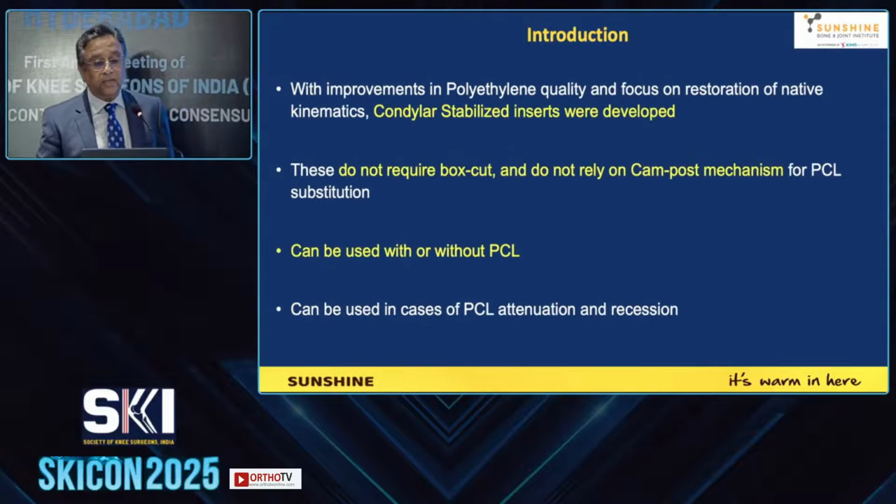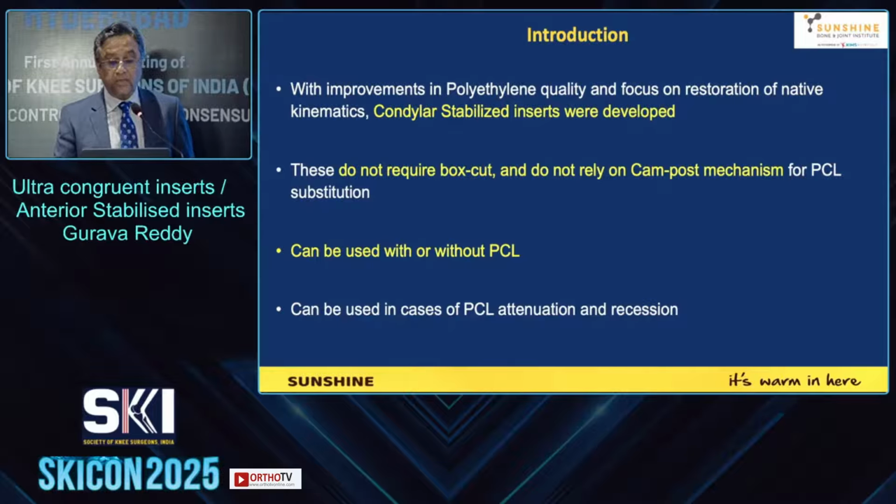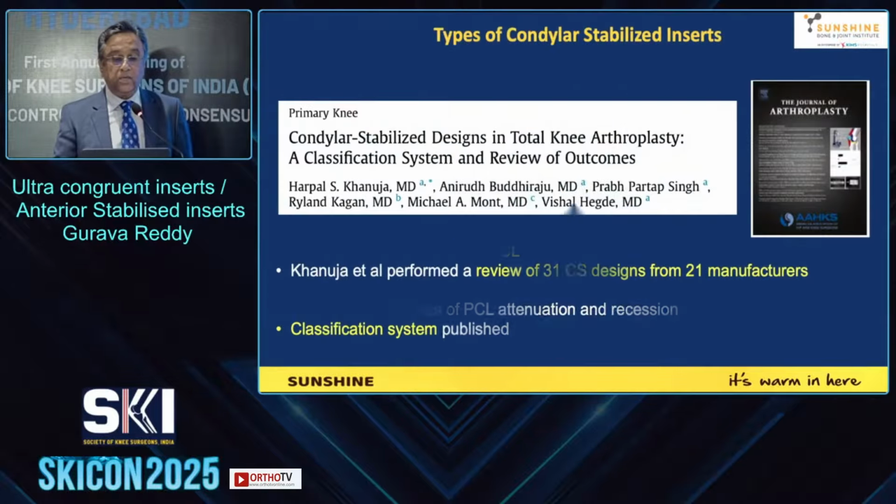With improvements in polyethylene quality and focus on restoration of native kinematics, condylar stabilized inserts were developed. These do not require a box cut, an important point, and do not rely on a cam-post mechanism for PCL substitution. It can be used with or without the PCL, and in cases of PCL attenuation and recession.